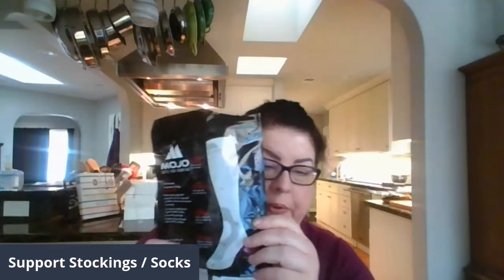I want to talk to you guys today about support socks or stockings — people have different words for it. I have fallen in love with the Mojo brand, and I've tried a lot.